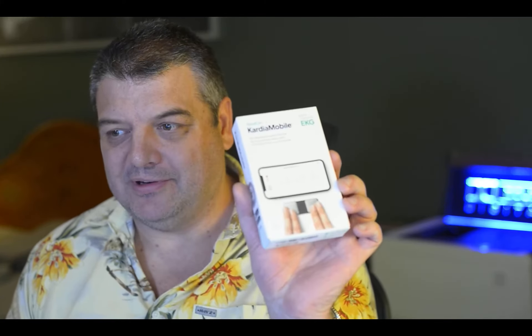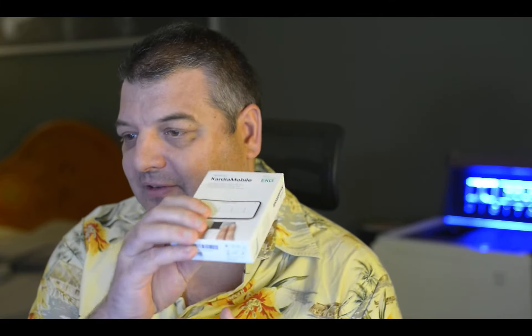I've got this little gadget I bought. It's called a Kardia Mobile by AliveCor. I saw it on the news. It was being used in hospitals and so forth to do screening for cardiac conditions. It's like a portable ECG basically.